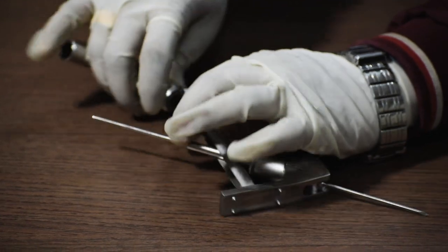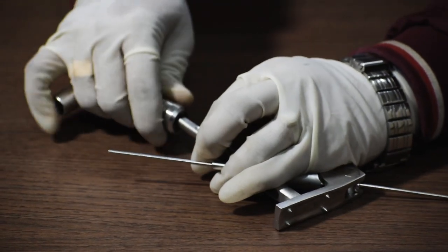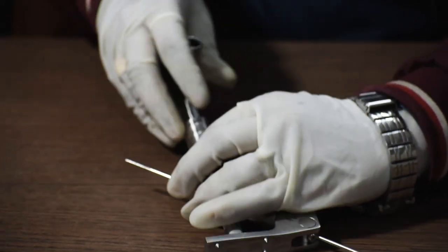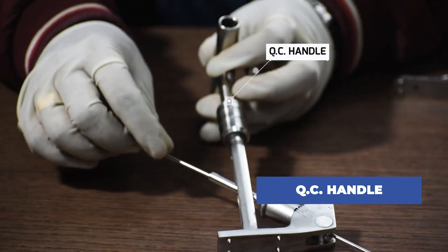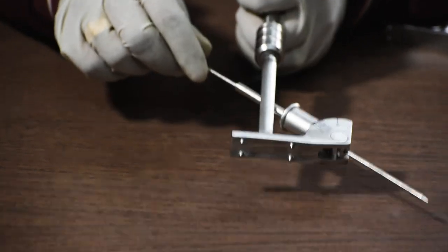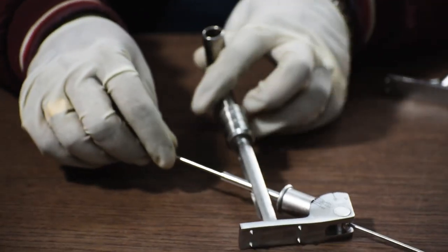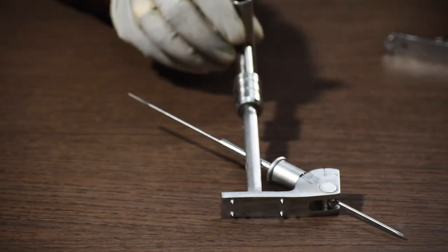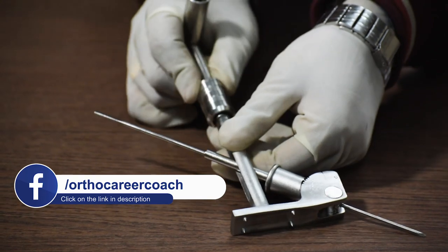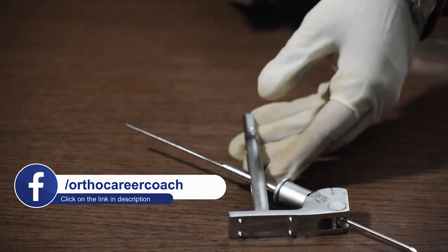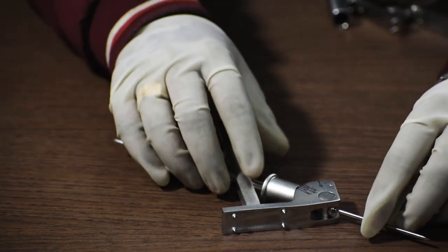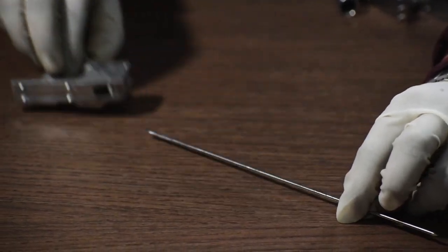Now in order to insert the guide wire, we will need a QC Handle attachment for gripping. This allows us to hold the angle guide properly while inserting the guide wire. After this we remove the QC Handle and remove the Angle Guide.